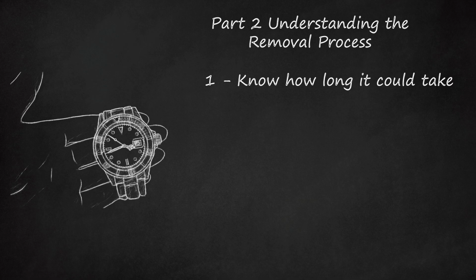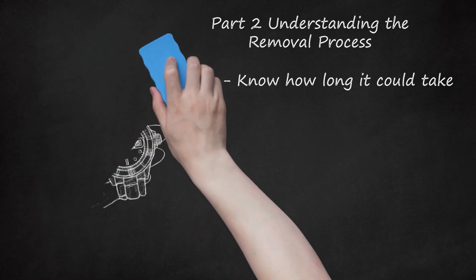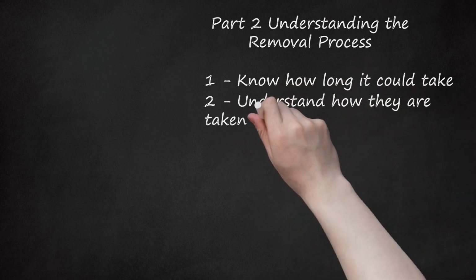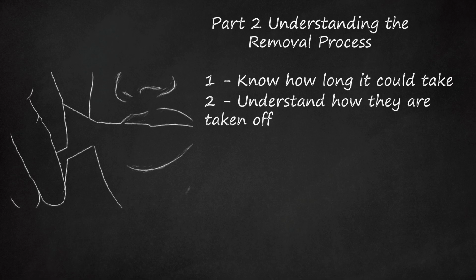Just removing the braces could take only a few minutes. After the braces are off, there is more work to be done by the orthodontist. 2. Understand how they are taken off. To remove your braces, your orthodontist will use special pliers to gently squeeze each individual bracket. This will separate the bracket from the tooth. Most often the bracket will come off in one piece, and they will repeat this for your whole mouth.